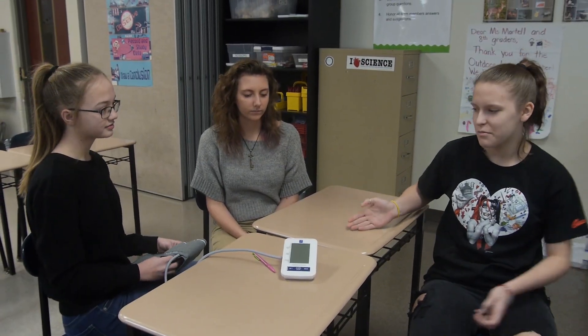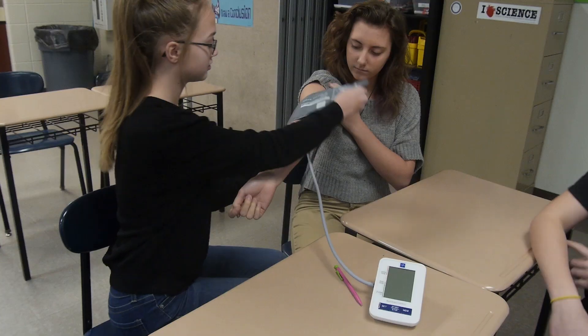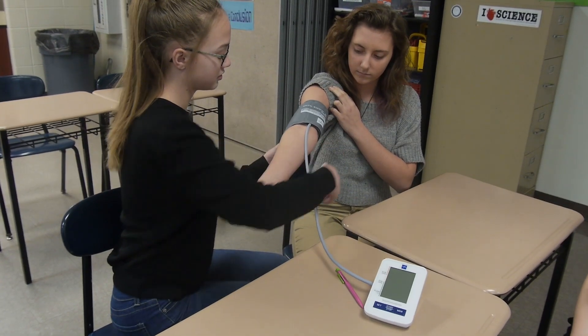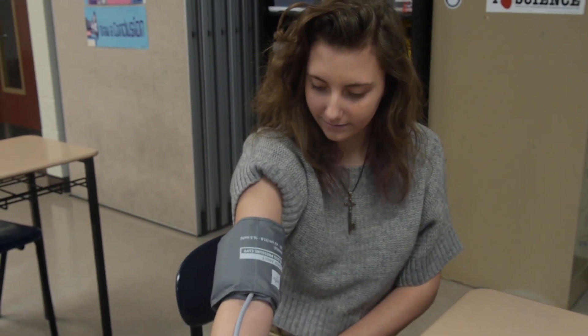We're working on blood pressure. You slide the cuff up so that it's a few inches above the bend in your arm, and you have to make sure the cord goes down that part of your arm. You're not supposed to talk — you're supposed to just relax.